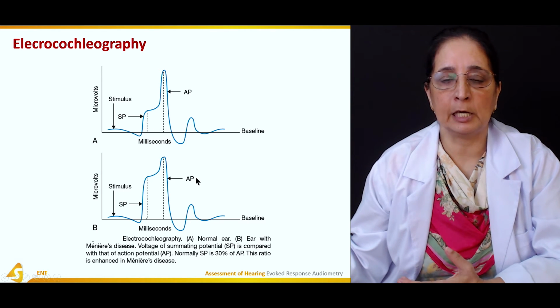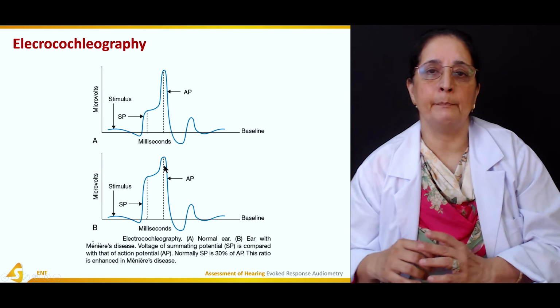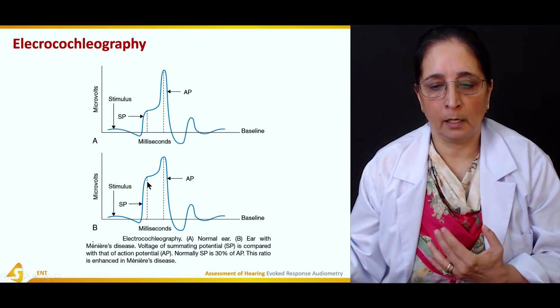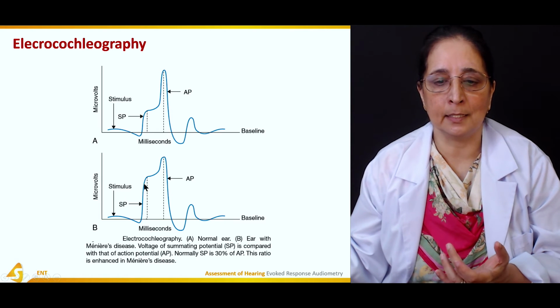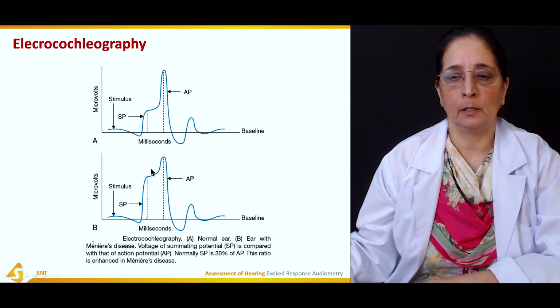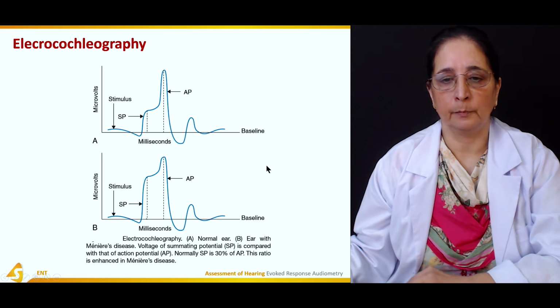But after the electrocochleography, if this is the case in patients who have Meniere's disease, the summation potential to action potential ratio is enhanced. After the stimulus, the summation potential is enhanced, and it's a lot more than 30% of the action potential.